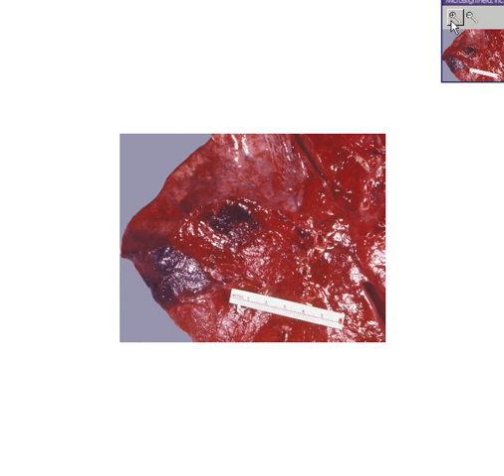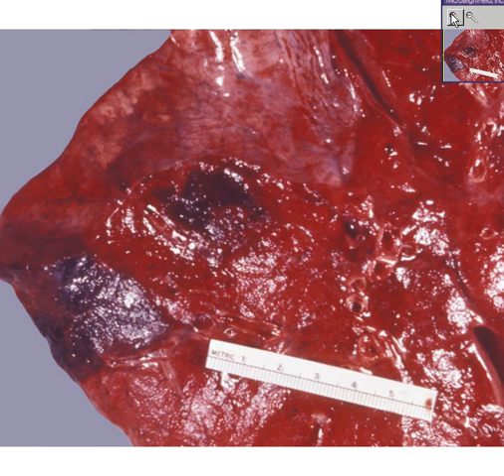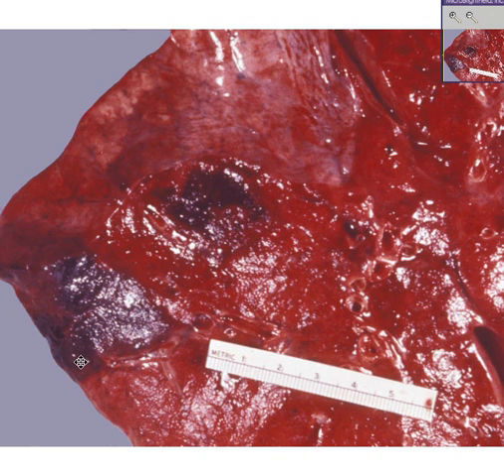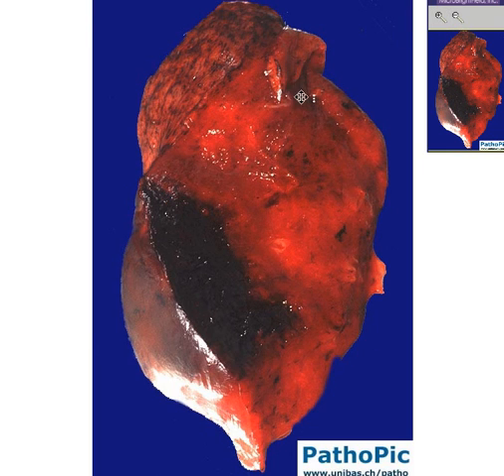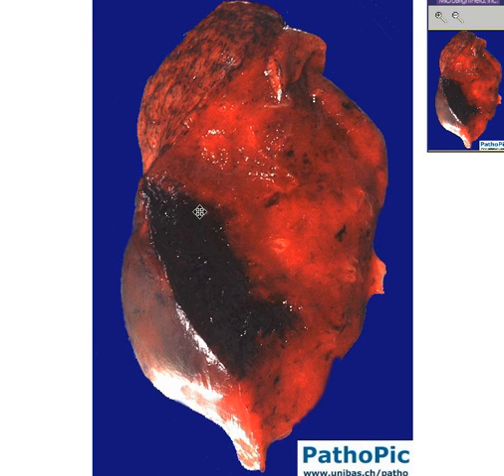Here is another picture that shows a hemorrhagic area a little more closely. You can see that there are areas where the pleura looks normal, but there are also areas where the pleura is hemorrhagic, and if you were to cut through that pleural area you can see that the hemorrhage extends into the parenchyma of the lung as well.